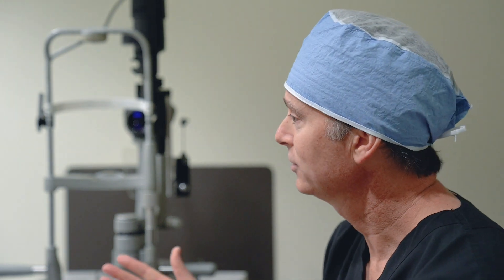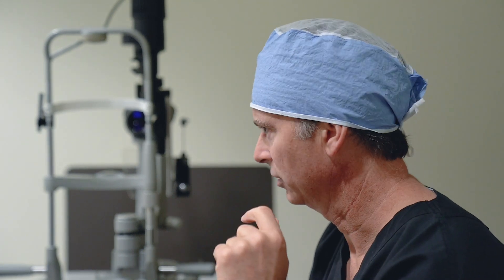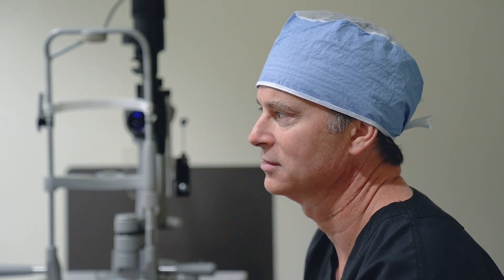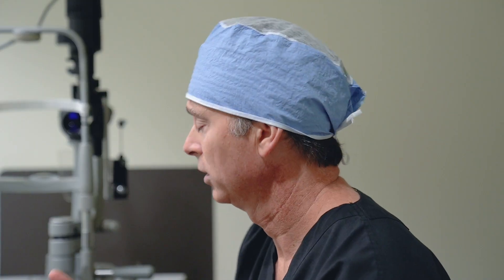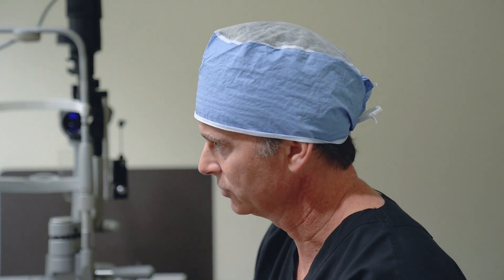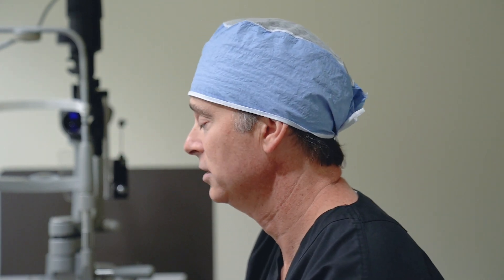When we get going, I'll guide you through the steps. The procedure is going to take place in two stages. The first stage is the creation of the LASIK flap, and there's going to be a little device that's going to come and put some pressure on your eye to keep you from blinking. That treatment takes about 20 seconds — it's kind of over before you know it. We'll do one eye under that machine, then the other eye, and then the bed swivels under the second laser, which does the recurving of the surface of the eye. That's usually the easier part.